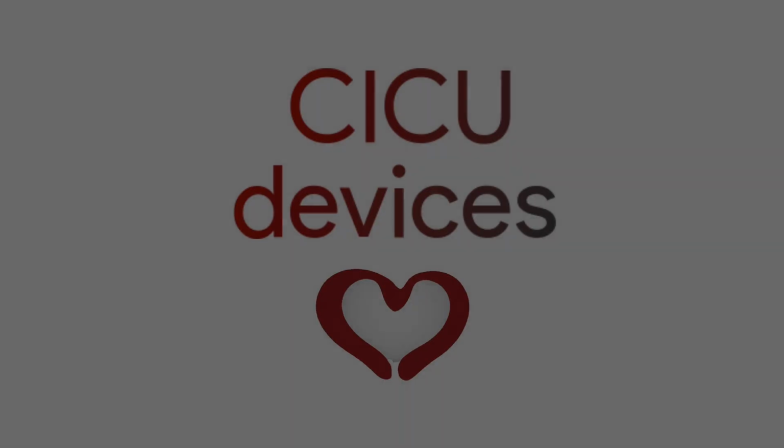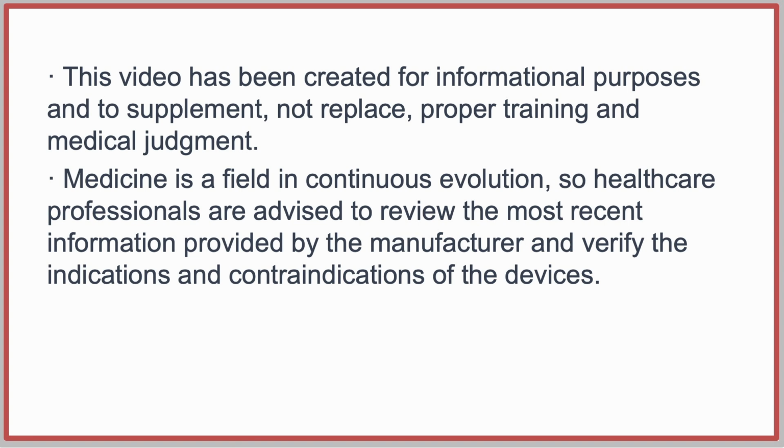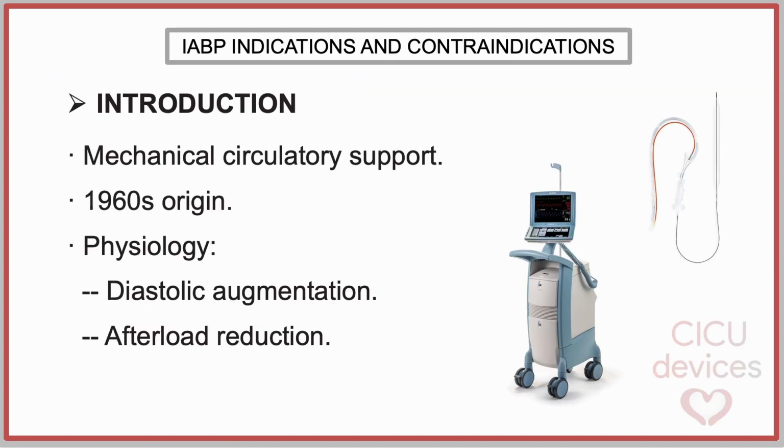CICU devices. Intra-Aortic Balloon Pump, indications, contraindications, and off-label use. The intra-aortic balloon pump is a classical form of temporary mechanical circulatory support. Introduced in the late 1960s, it remains one of the oldest and most extensively studied cardiac assist devices.